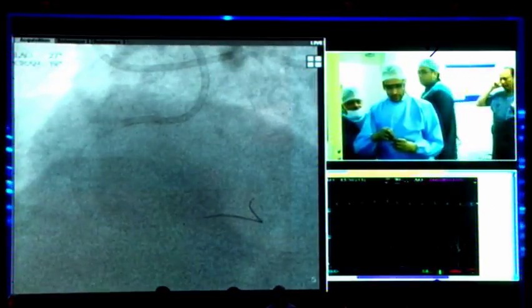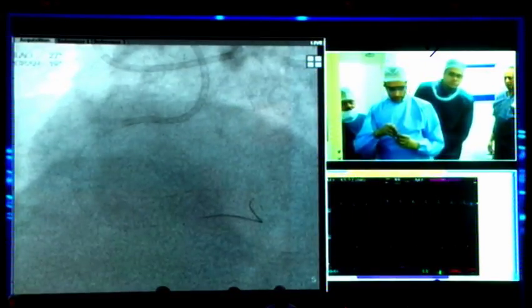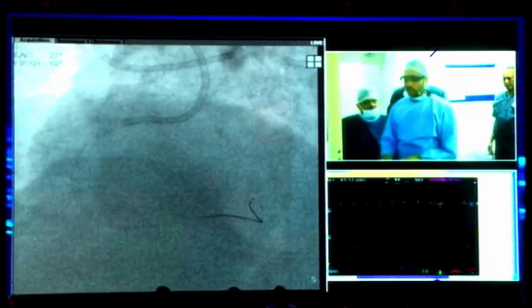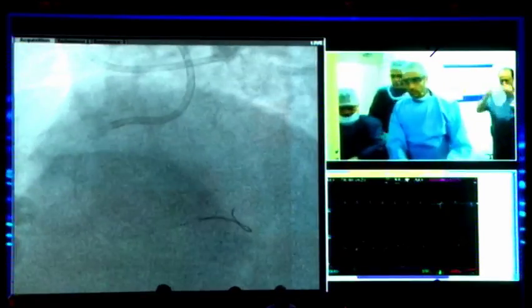It's a 1.5, right? So now you are going to balloon it. Yep. Moment of truth. And that's okay. I mean, we have done ADR after a 1.5 balloon when Boss won't go and Stingray won't go. So it's all right. Like I said, the only thing not to do is tent into badness.